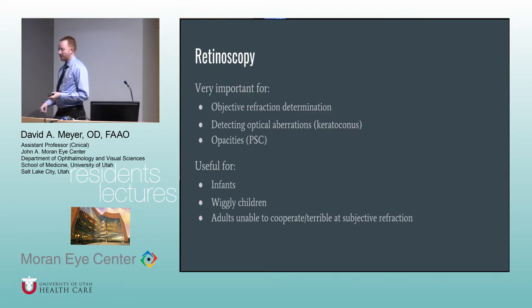So we're going to start with retinoscopy, which is a bit of a lost art. In the days that we have autorefractors and stuff, a lot of times the retinoscope is just kind of thrown to the side. But it's incredibly useful. To this day, I use it all the time. Obviously, it's really good to get an objective refraction determination, even if you're in the ballpark.